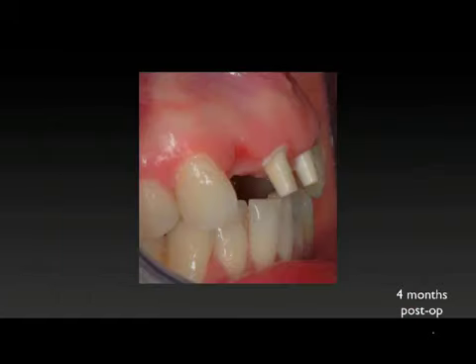The angulation is without an issue. You can see with a more distant implant against that canine that we have more than enough space for our restorative materials. This is a rather inclined maxilla, and we still don't have angulation issues. So the one-piece design is extremely flexible. You have a lot of options in terms of restorative protocols, in terms of restorative flexibility, even though you have a one-piece design. This is replacing a tooth.